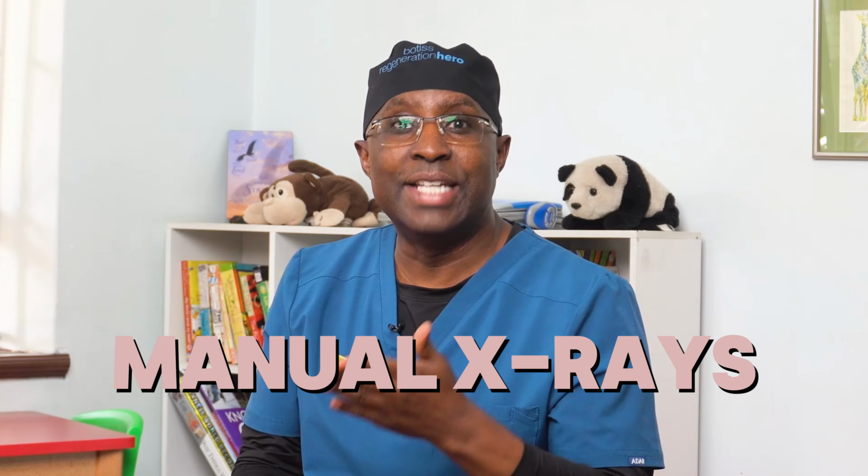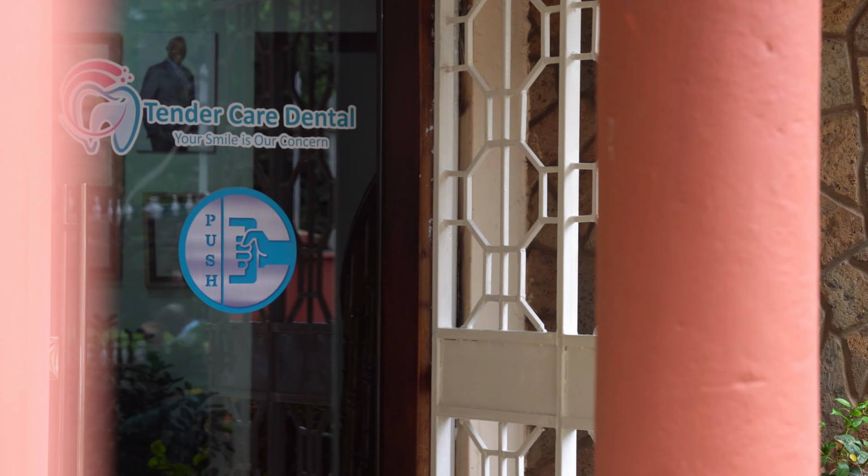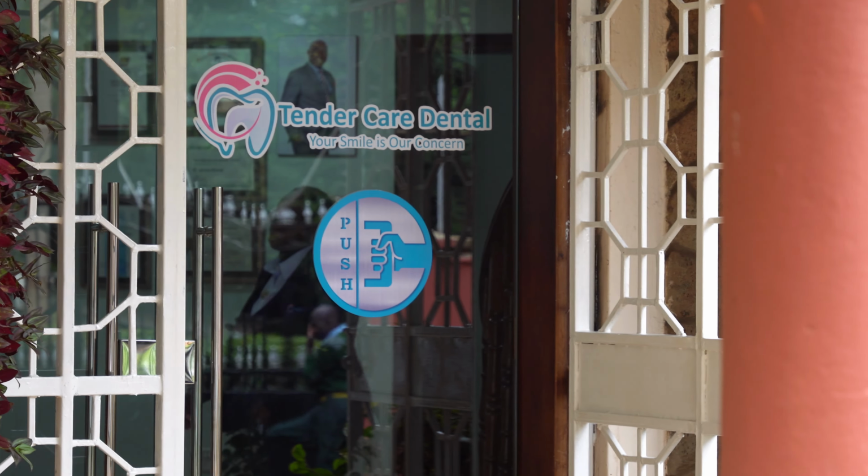Previously, there was what we call the manual x-rays, where we use dental films, and then you had to expose those films, take them to a dark room, develop them, and then from there you are able to see the x-ray. There are still many offices which are still using that. But at Tender Care, we've moved away from that. We are now using digital x-rays.